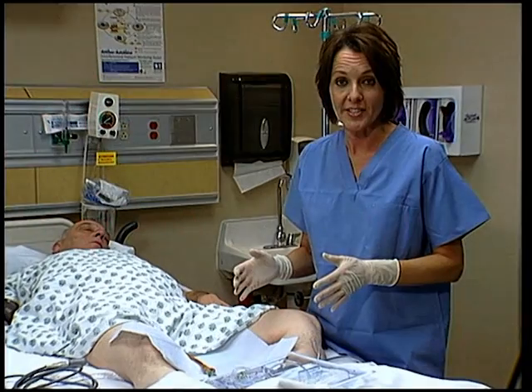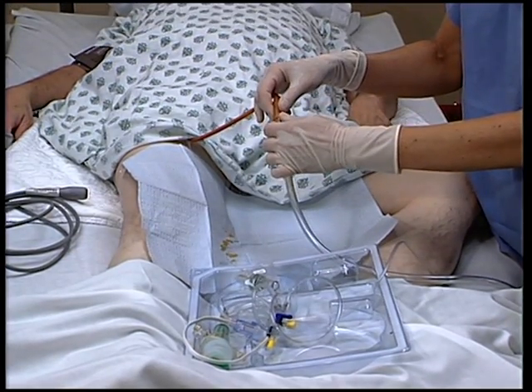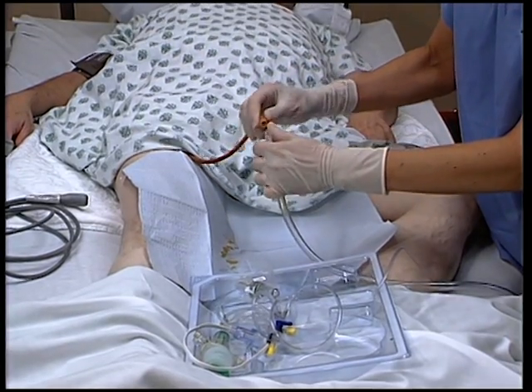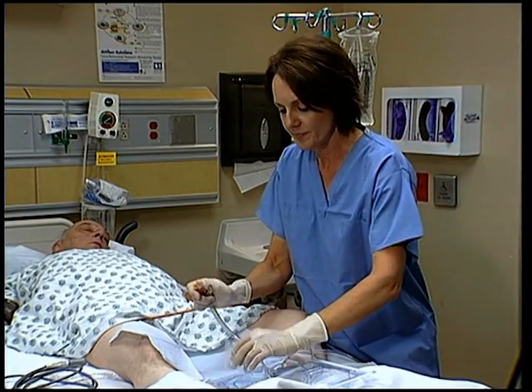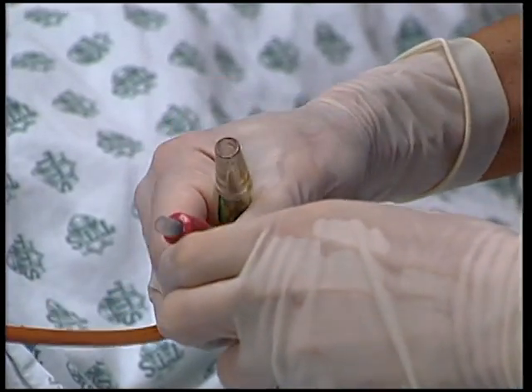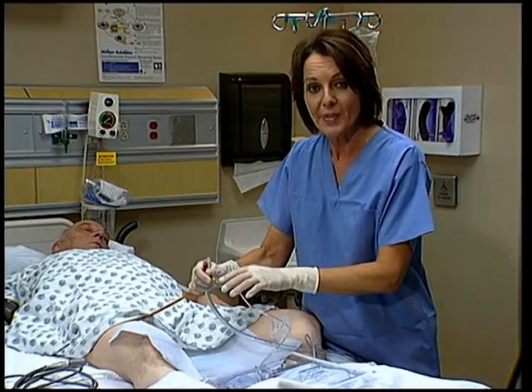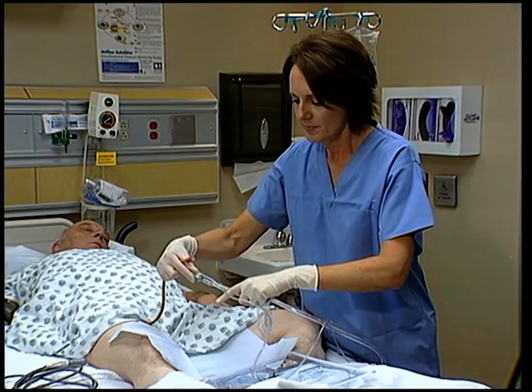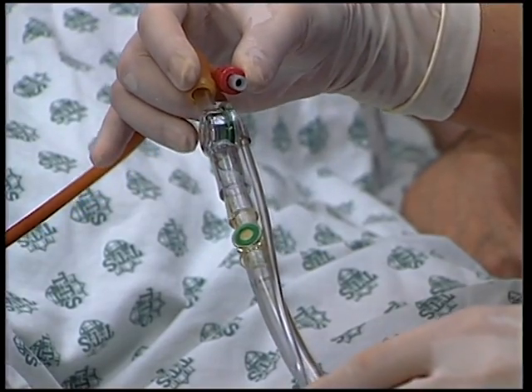It's now time to attach the AbVisor to the patient. Place the AbVisor tray with all contents onto the bed between the patient's legs. Disconnect the Foley from the drain bag and hold both exposed tubes upright to prevent urine from leaking. Pick up the AbVisor valve and tear along the perforation of the protective bag, exposing the barbed connector. Push the urinary catheter over the barb, then slide the protective bag down the tubing exposing the urinary drain connector, and connect the drain tubing to the AbVisor valve. Tear the protective bag at the second perforation and discard it. Note: once attached, the AbVisor valve cannot be disconnected without risk of damage.